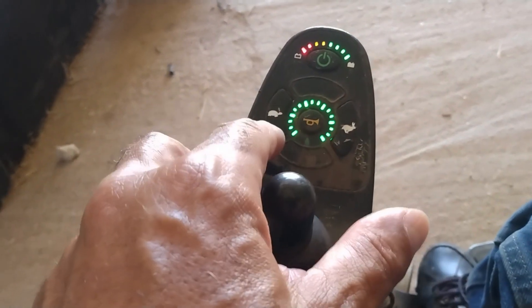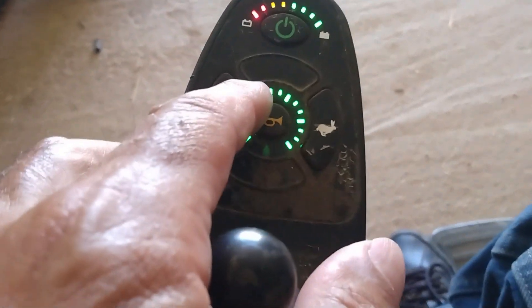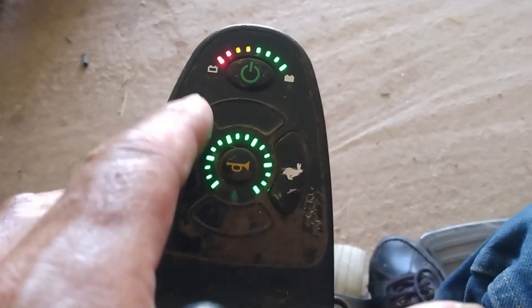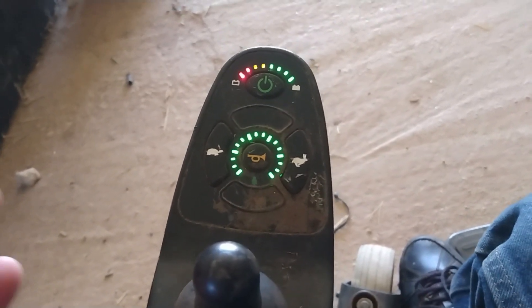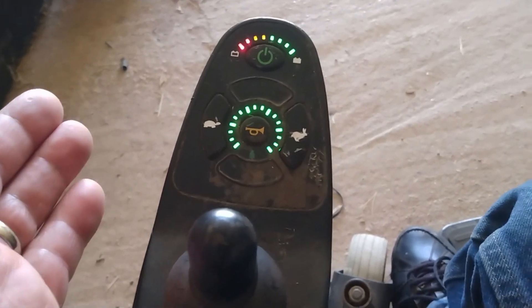He told me to turn it on and press the horn button twice, and that fixed it. Simple solution — if it happened to you, you can try it. It might work.